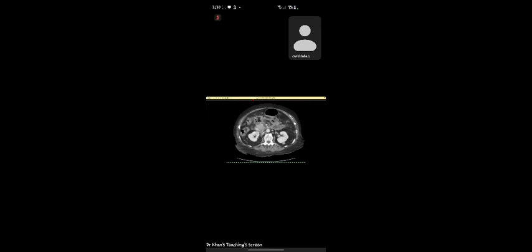This abscess may be a post-operative abscess or maybe fistulation. Sorry, I didn't hear exactly the history because I was busy about the control. Okay, thank you very much.